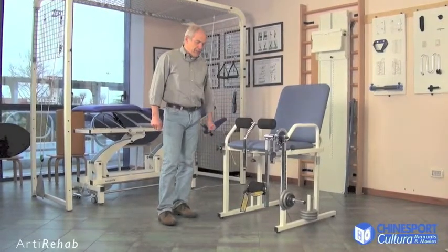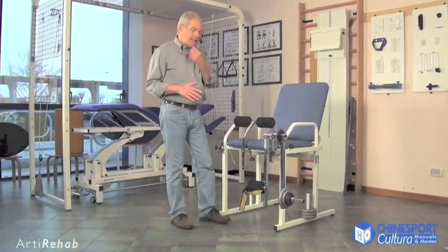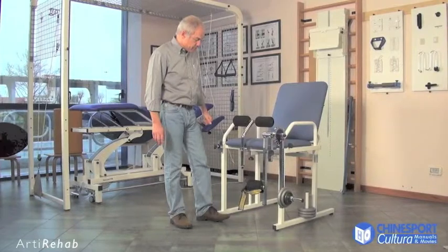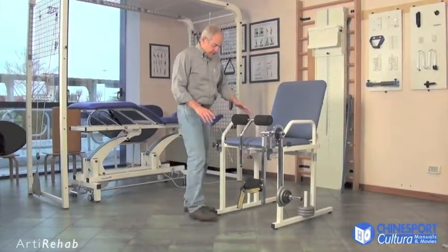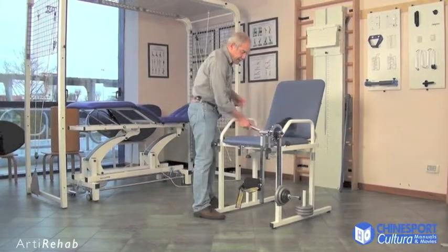Arty Rehab is a machine used to strengthen the lower limbs in terms of both extensor and flexor muscles. It is made up of a chair that is easy to use even for those that have difficulty moving.